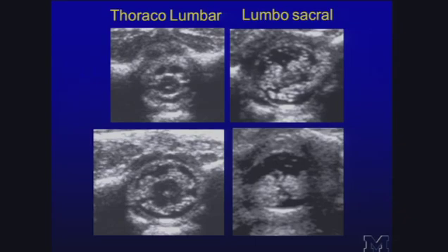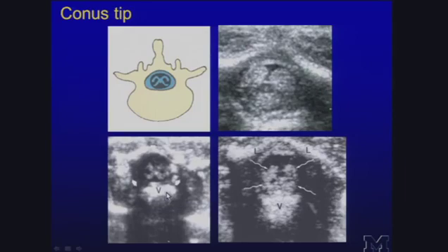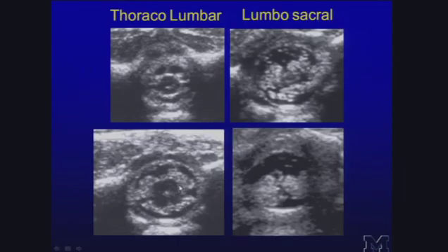Some appearances of the spinal cord as you look at the canal. Most of the emphasis is around where the conus is, but I often tend to look at the entire spinal canal. I'm not demonstrating cervical here, but notice, and these are all at the same magnification, I haven't changed it, how the thoracic cord is circular, but tends to be smaller than the low thoracic and lumbar cord, which is still kind of circular, but almost like a kind of box shape. And then it starts getting smaller again and tapering as you get down to the conus, and then the cord is gone, and all you have are roots of the cauda equina. Other things you can see, especially in the thoracic, you can see these horizontal lines in the 9 o'clock position and in the 3 o'clock position.